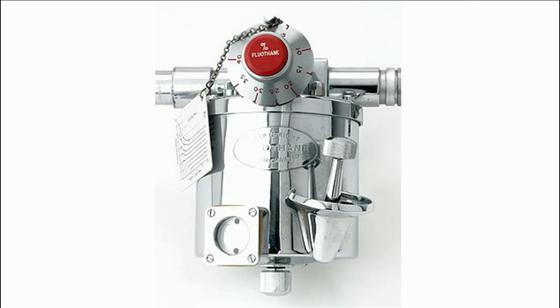Although primitive by today's standards, this vaporizer established the basic architecture of the precision plenum vaporizer. In many respects, almost every conventional vaporizer that followed owes its design to the engineering principles first demonstrated by devices like this. The story over the next 60 years is therefore not one of completely reinventing the vaporizer, but one of progressively refining the original concept. Engineers improved temperature compensation, increased output accuracy, reduced maintenance, added safety systems, and eventually introduced electronic controls. But the journey really begins here.